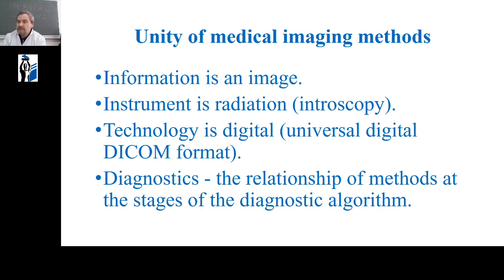If radiation diagnostics and images give a native image of intact tissue, then they need to be studied, gaining new and very important knowledge. And this image is obtained with the help of various types of radiation.